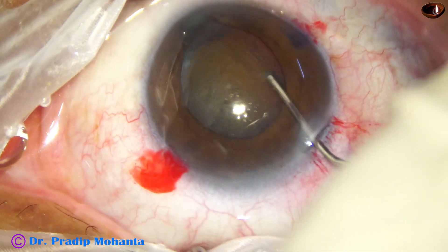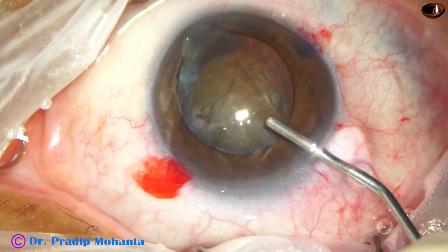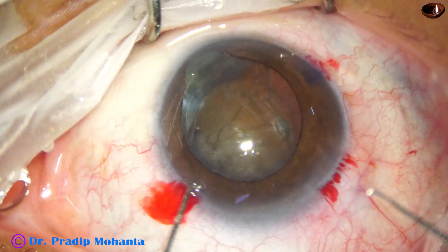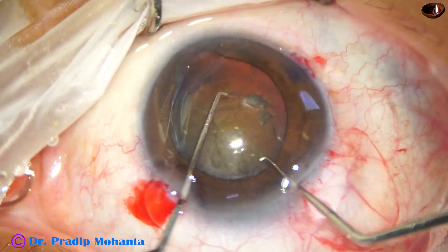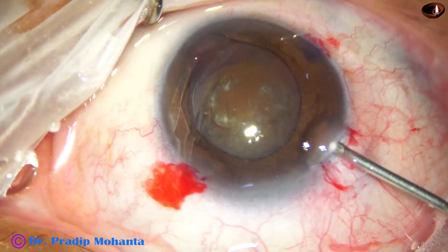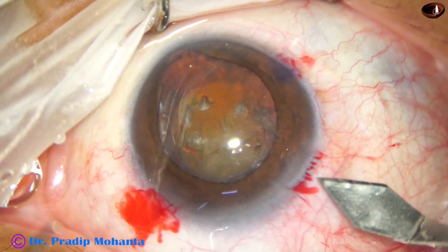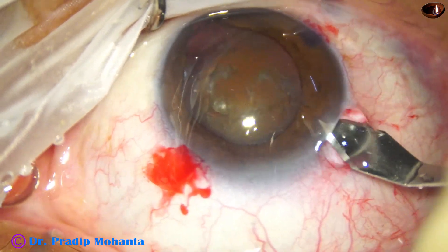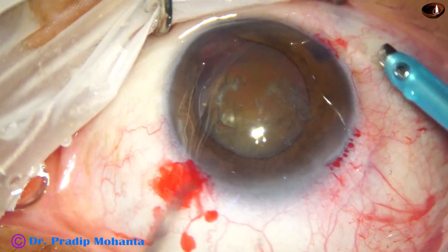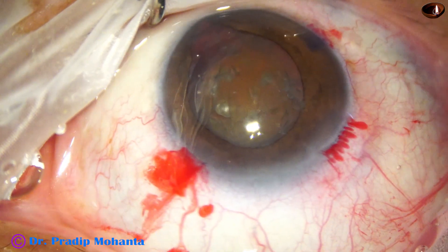For that, I have to divide the nucleus into smaller pieces. Before that, I am rotating the nucleus with two hooks bimanually. Now is the time to introduce the phaco needle. The wound is enlarged to about 3 mm, and now the phaco needle goes in.